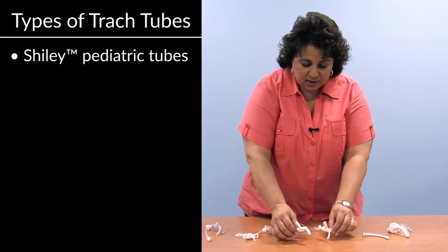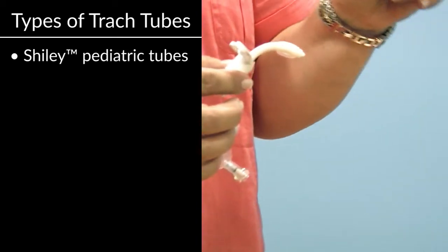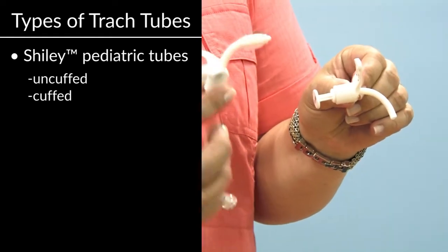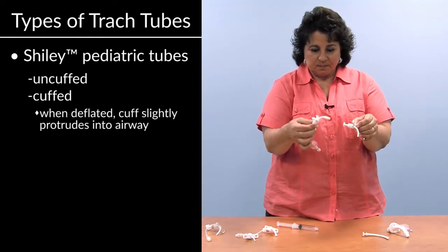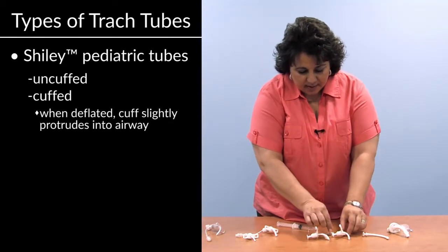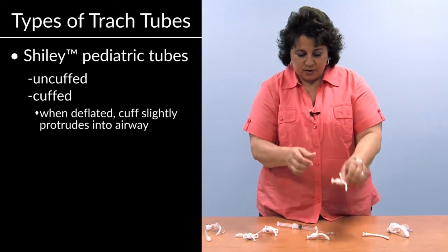These are Shiley tubes for pediatrics. This has no cuff. This is cuffed. You'll see the difference on them. And again, this is the air cuff so that when it's deflated, it still does protrude into the airway a little bit. They both have their obturator as well for insertion.